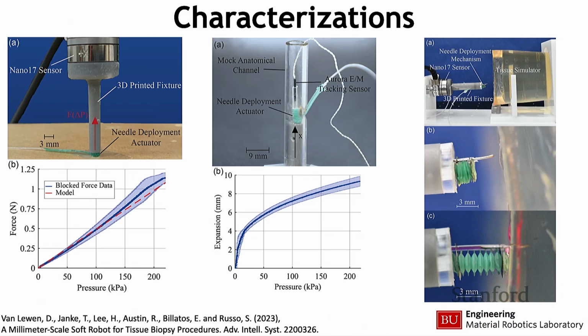We were also able to demonstrate that we have created origami-inspired soft robotic mechanisms that can help the surgeon control the needle deployment inside the lungs to take biopsies. In this case, we have a needle attached to a soft robotic origami-inspired actuator that can basically command the puncturing of the tissue. Next steps are going to be integrating steering, because sometimes when you are at a location where you want to take a biopsy, the tumor is located maybe close by, and so you have to achieve pretty sharp bending angles to make sure that you can puncture your way through.